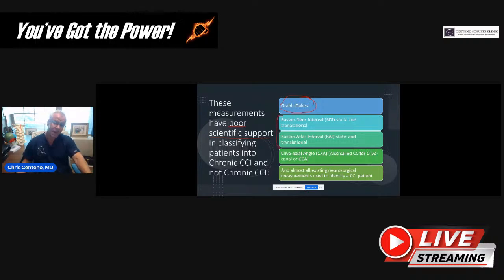You hear about these all the time, right? BDI, BAI, static BDI, static BAI, translational BDI, translational BAI. Again, poor research connecting those abnormalities to symptomatic CCI or chronic CCI. Clivo-axial angle, and it's got lots of different names, also called a CXA or CCA. Again, poor connections. So we're going to go through this concept, and I'm going to focus today on clivo-axial angle because I can go through that research relatively quickly. And this is one that's used to define whether or not someone has cervical medullary syndrome and consequently needs surgery.